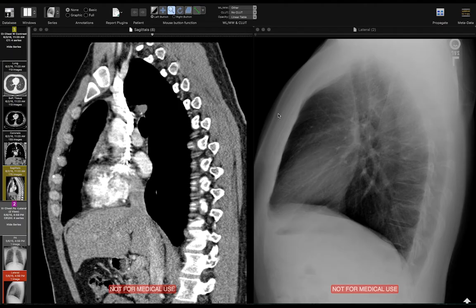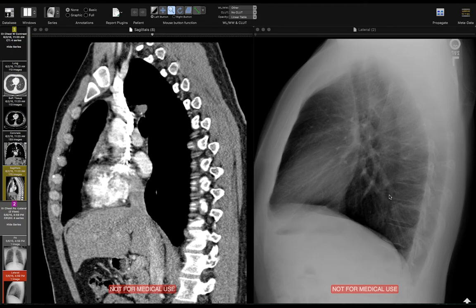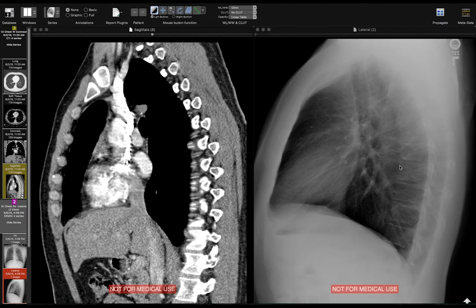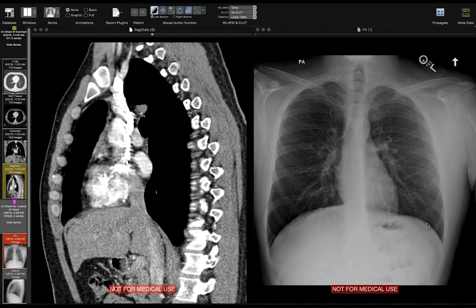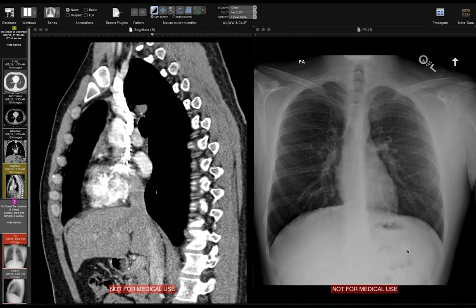Once you're done looking at the frontal radiograph, the next thing to do is look at the lateral radiograph. There are a few clear spaces you should be able to identify in all normal patients. This is the sternum, and right behind it is the retrosternal clear space. This is the trachea, and right behind that is the retrotracheal clear space. And this is the retrocardiac clear space. These are all areas of lung you should be able to identify on normal patients. Also on the lateral radiograph, you have the costophrenic angles, which are much more sensitive in detecting fluid than the frontal — it only takes about 50 milliliters of fluid here, whereas it might take 150 milliliters to show an abnormality on the frontal.